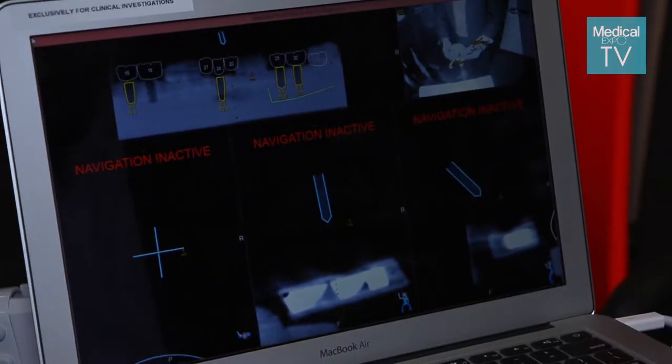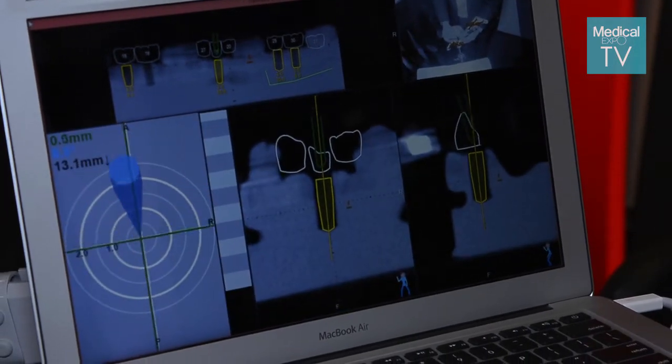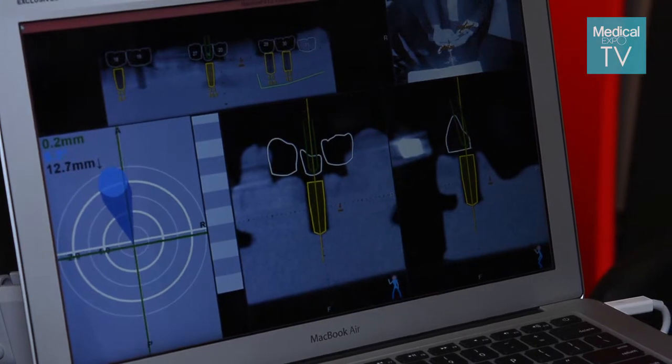The camera maps the tip of the drill to the CT scan so that wherever you place the virtual implants will guide you where you're actually going to drill to place the actual implants.